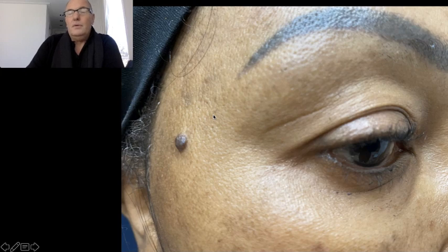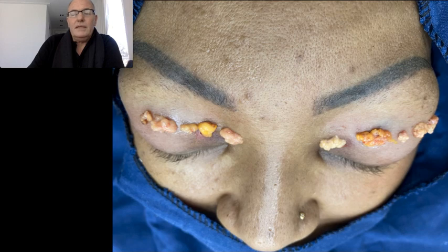In a closer view, we can see the sagging skin, upper fat pads, here, here, here. You can see the skin, and also the eyebrow skin is sagging. The conventional resective blepharoplasty is going to leave a scar from here to here. You can see a lot of sagging skin.